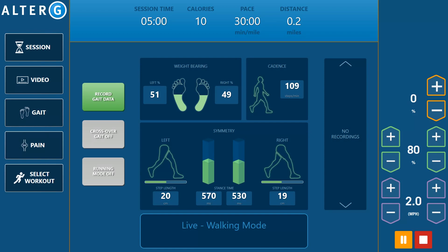Visual feedback can help determine the precise body weight percentage needed to optimize their rehab and training program, helping identify and maintain proper biomechanics and avoid the development of compensatory gait patterns.